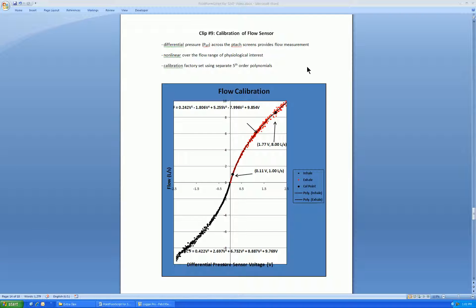In this clip I'll discuss calibration of the flow sensor. As with the gas sensors, the flow sensor has been calibrated at the Qubit factory and should not drift. However, you should be aware of how to check the flow calibration and to change it if necessary.